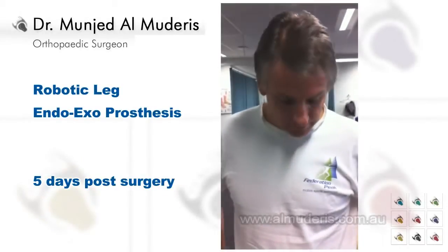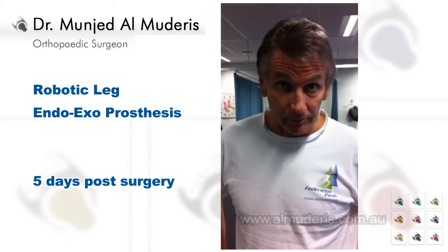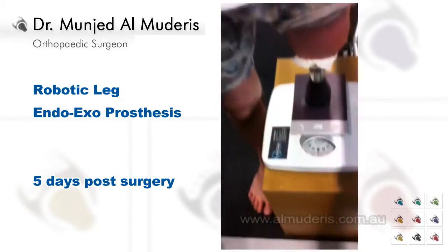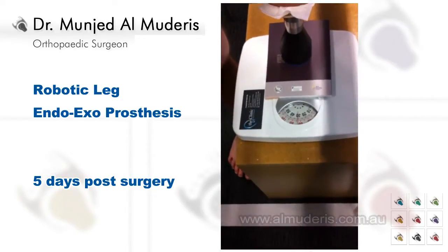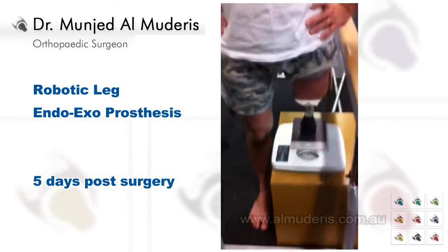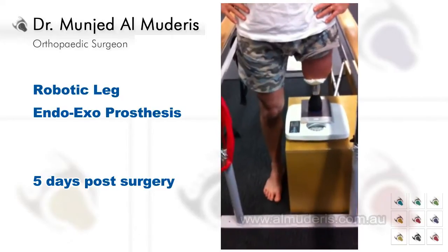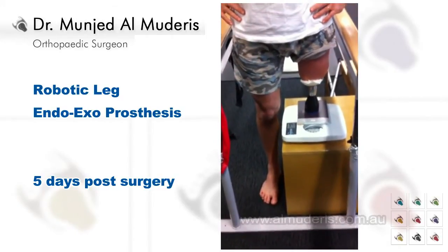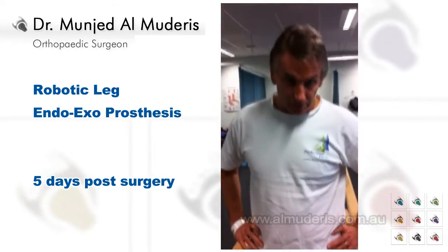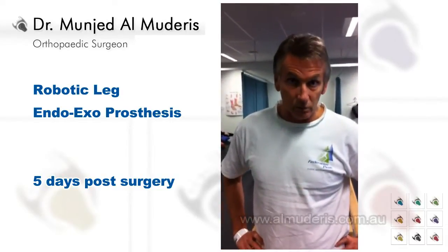So what are you doing? 10 minutes at 30 kilograms. And that's how many days now after the surgery? Five days. And we just alternate five minutes of constant and then five minutes of zero out of 30. So it simulates walking.